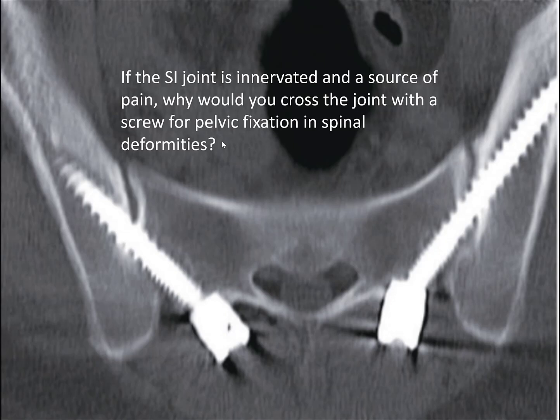If you think about it, if you're fixing that joint, then maybe you're stopping the motion, especially if you're getting good fixation. I hear you. So I think you're not. It's when the screws start to get loose. Well, do you guys see that? Junction.